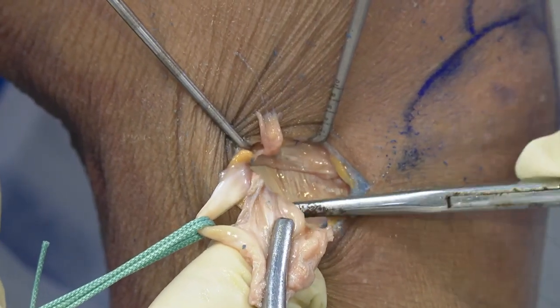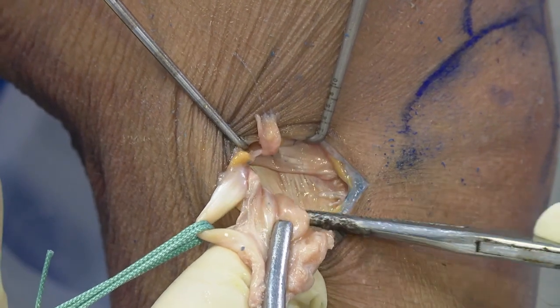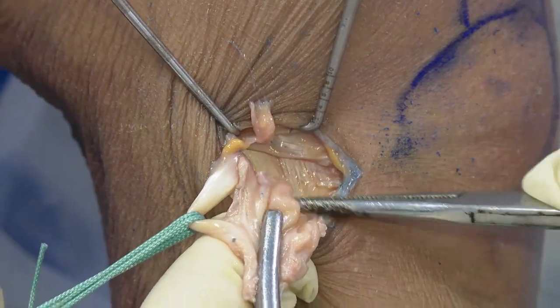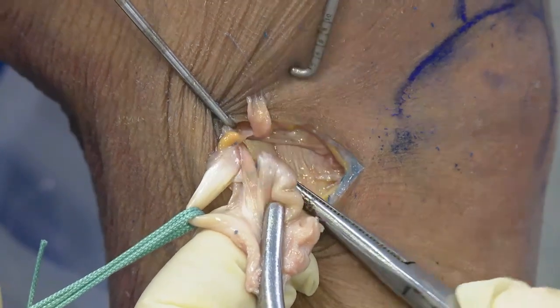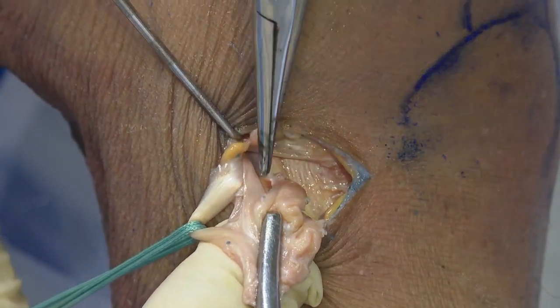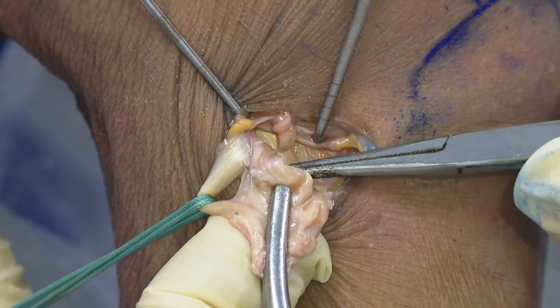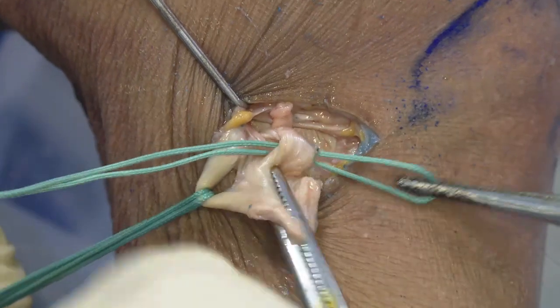Okay, the gracilis is done, so next we look at the semitendinosus. If you have the right angle it should be fine, okay? The angle should be like this. If it's not right angles, no problem, we can try to make it. So this is the semitendinosus, okay? This is the semitendinosus. So, this is semitendinosus, okay, here.